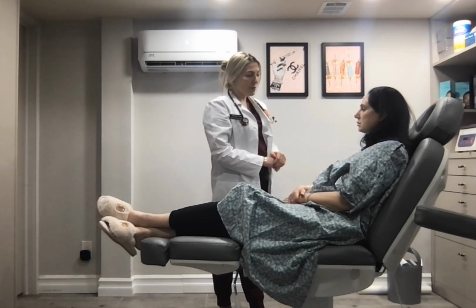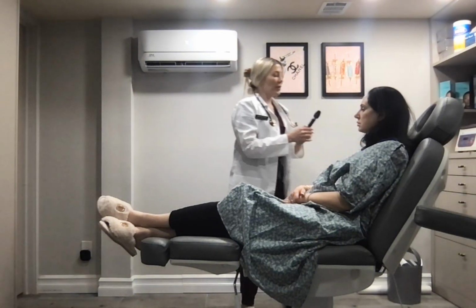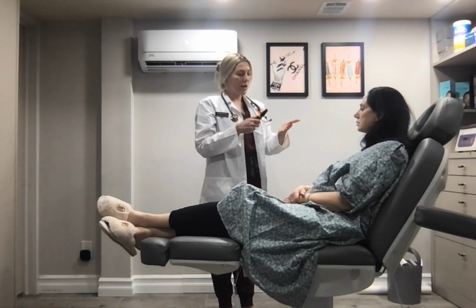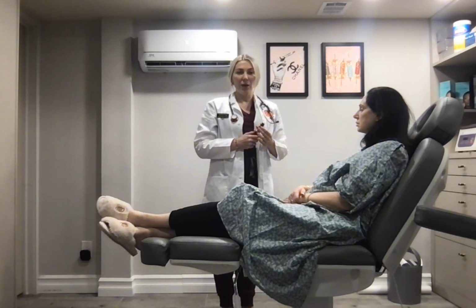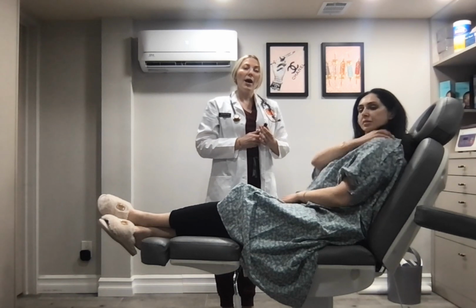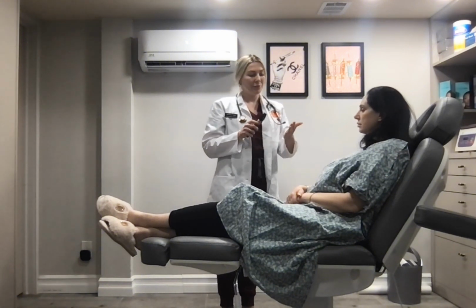Next, I'm going to be assessing her pupil reactions. I'm going to get my light. Okay, turn this on. This is the ophthalmoscope, and I will be checking her red reflex, the retina, the vessels, the optic disc, and the macula, as well as the pupil constriction, making sure that they consensually and directly react to light. Okay.